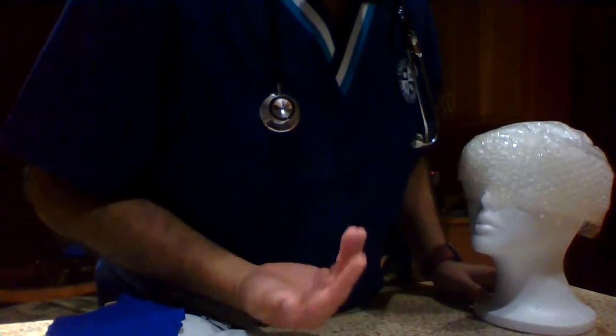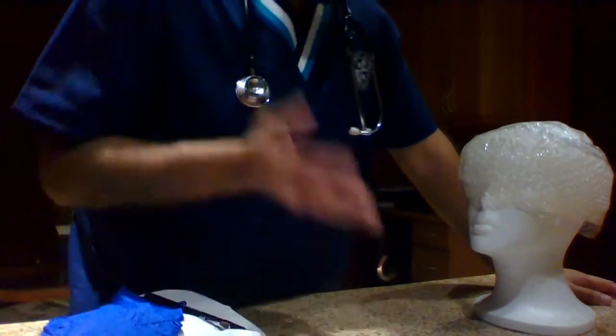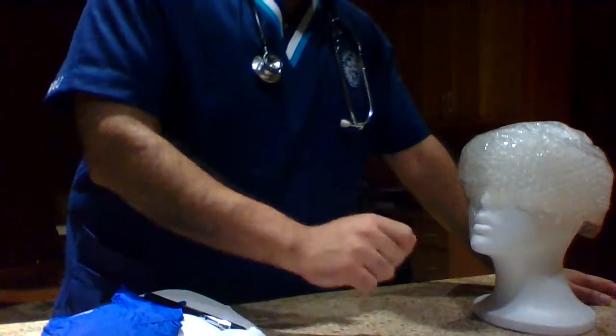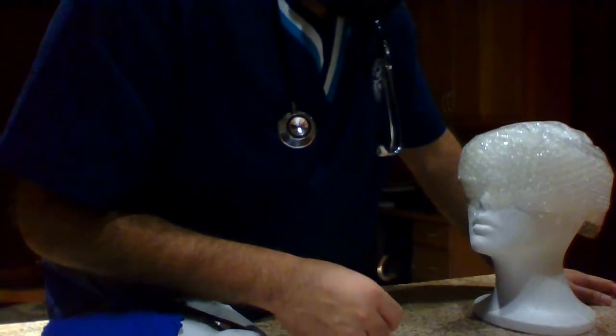So then we do the patient teaching. Again, we're going to explain the procedure and develop an appropriate hand signal for the patient. This is just for if there's anything that they feel uncomfortable with, because I will be sticking tubes in and having them swallow and keeping them busy throughout the time. Really, a hand signal is the easiest thing to do.